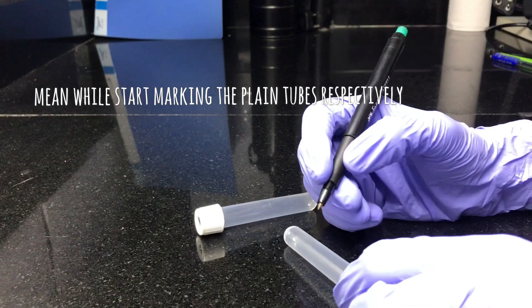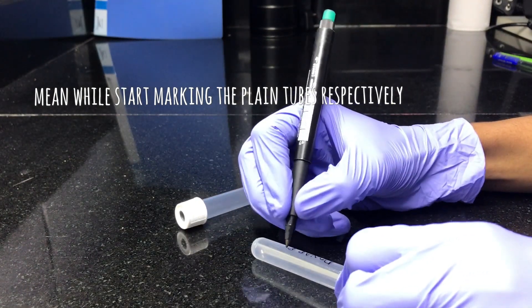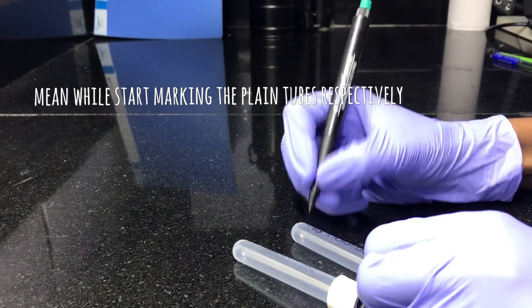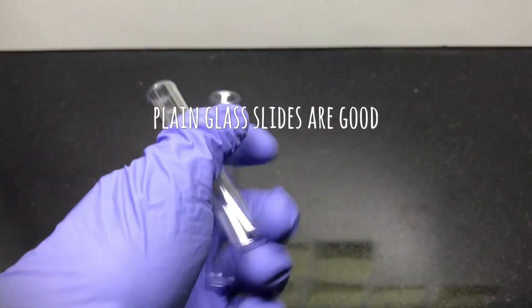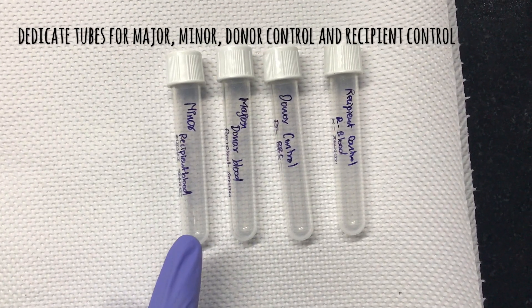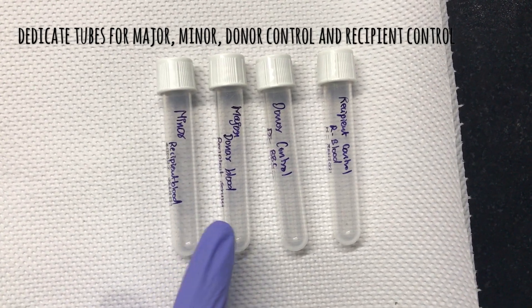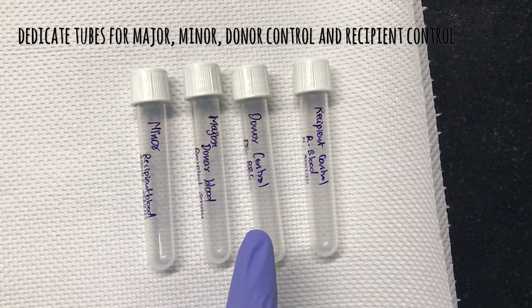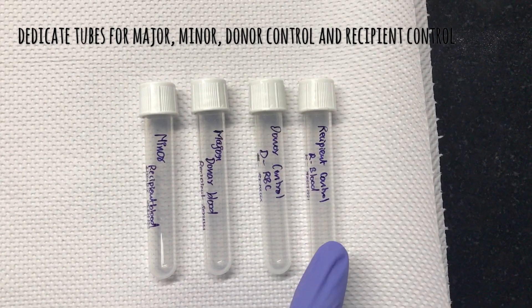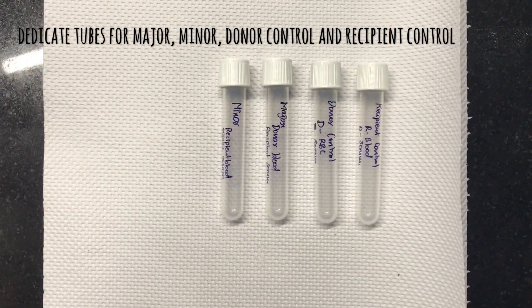While the centrifugation is going on, start marking the test tubes. Take 4 clean glass test tubes and mark them as follows: donor blood with recipient serum as major; recipient blood with donor serum as minor; donor control will have donor blood and donor serum; recipient control will have recipient blood and recipient serum respectively.